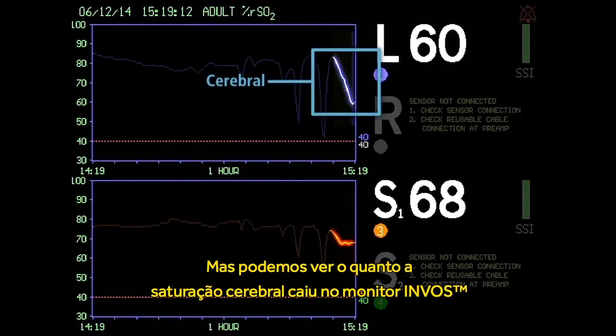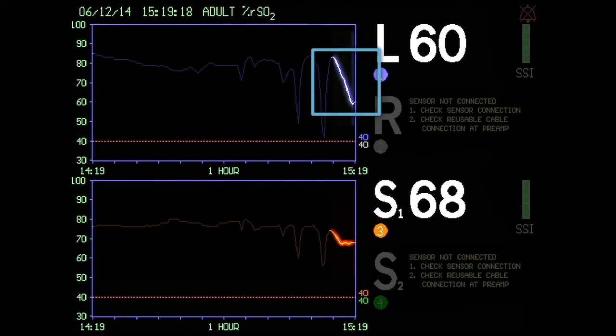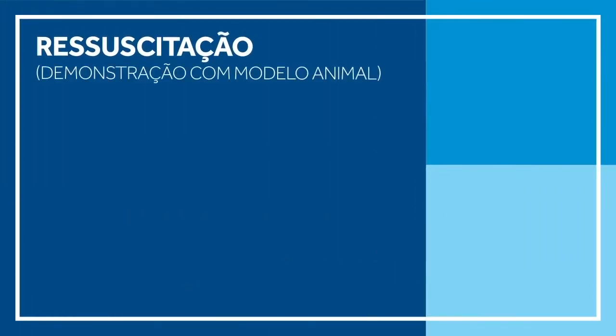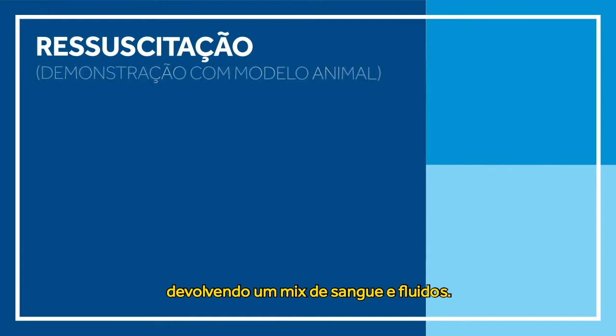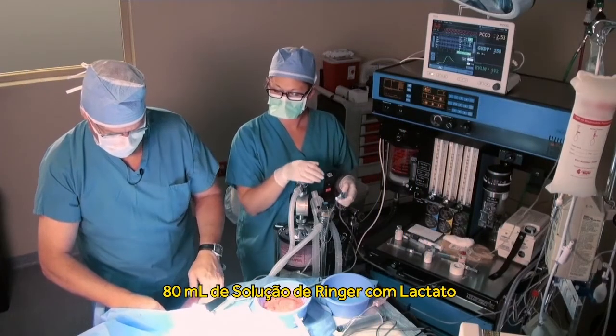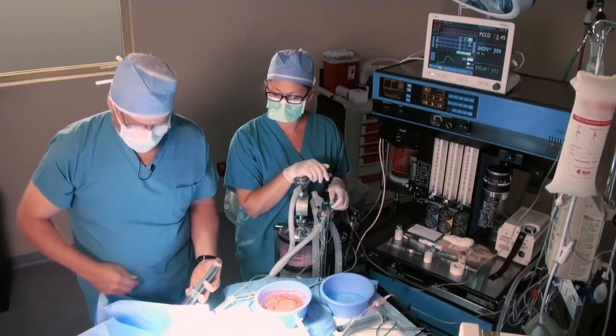But you can see how quickly cerebral saturation fell. As soon as I started to remove blood, saturation fell. There was no other indication of bleeding. Now I will resuscitate the patient by giving a mixture of blood and saline back. So there was 80 milliliters of lactated Ringer solution. Now we're going to do some blood on top of that.